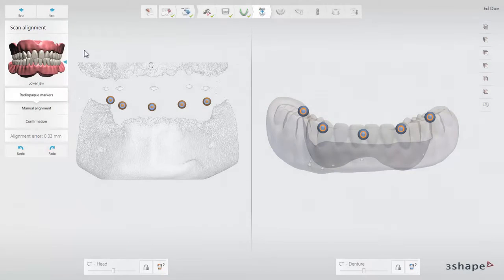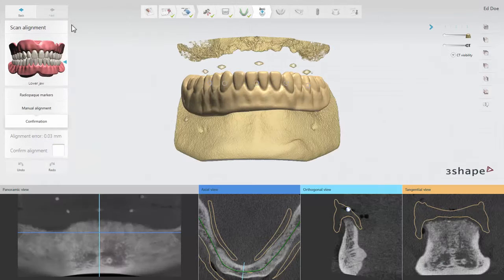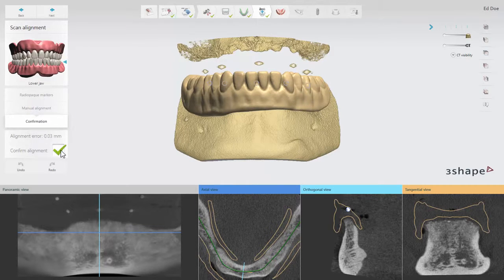If you are satisfied with the alignment, proceed to the confirmation sub-step. Confirm the alignment by putting a check mark. Click Next to proceed to the gingiva detection step.